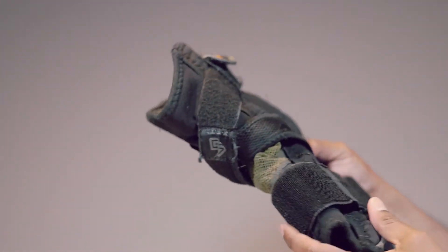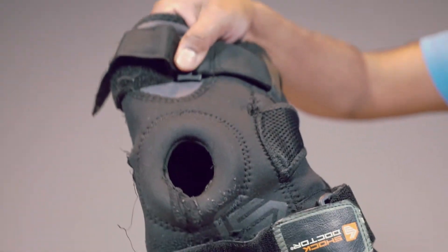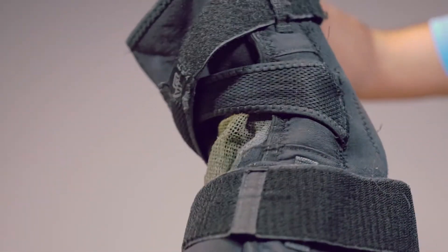I have another one here, just to show you the same product after extensive use. This is still usable, but of course, deteriorated a bit.